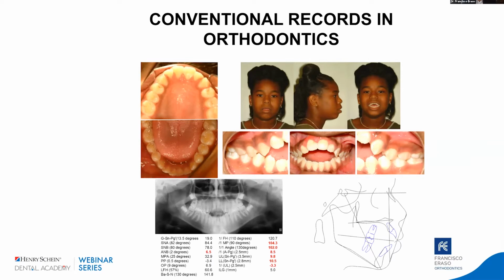This was my first orthodontic case in my office. We take, and we still take now, digital photographs, digital panoramics and lateral cephs. We trace the x-rays, and tomorrow I'm going to teach Indiana University residents, and we're going to say bye to this year's residents. They always take the same records, and they say, should I take a CBCT? And I say, for my cases, please, let's go ahead and take a CBCT in all of the cases.